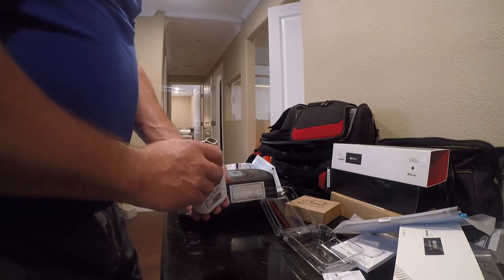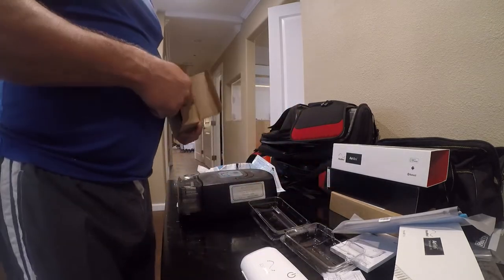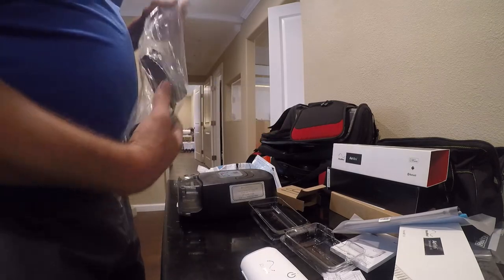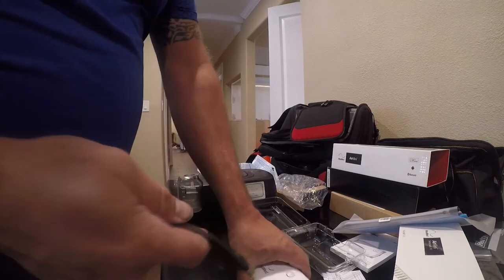It has a Bluetooth interface and it uses a funky cable, so I had to invest in some more stuff. It comes with a little tiny power cord. I don't understand why they can't just move to USB-C on this stuff, but it is what it is.